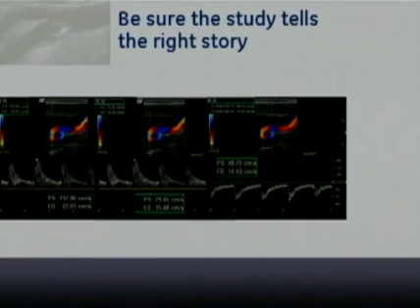Now, as I came around the coil, continuing to sample, all of a sudden I get a velocity that's 48 centimeters per second. Again, this makes absolutely no sense. It's an angle correction error. Even though the image looks like the angle correction is accurate, it's not.